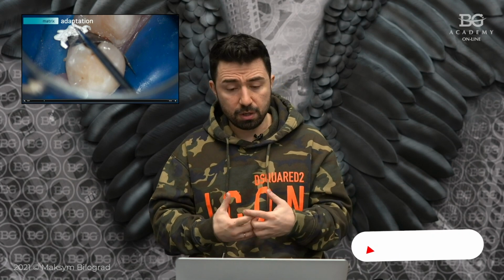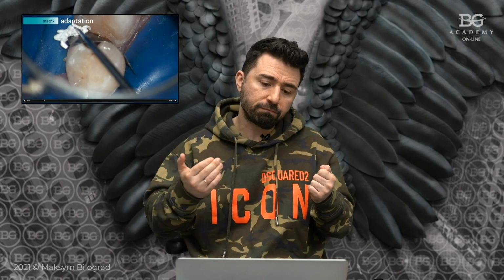Tip number two is that we stabilized the matrix with Teflon tape. There was no way to use a wedge, because if I used a wedge there, it would push my matrix inside the defect and we would have a reverse or negative emergence profile afterwards. So in this case it's better to do something different. We took Teflon and packed it between the adjacent tooth and the matrix, and Teflon brought the matrix to the cervical area.